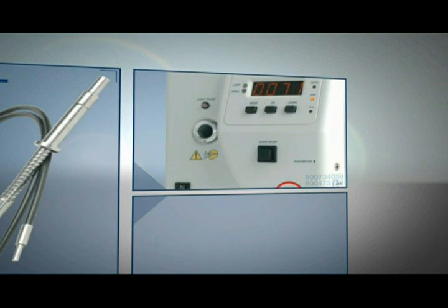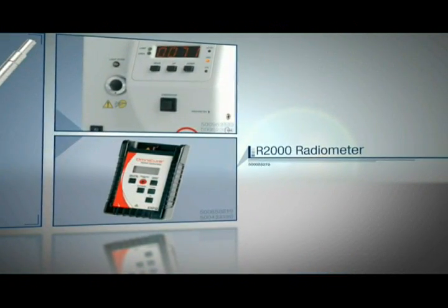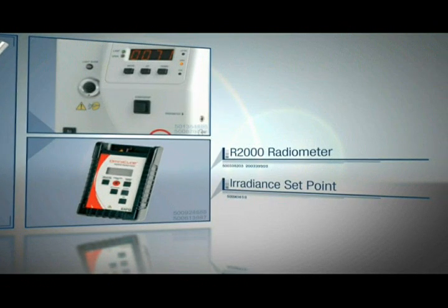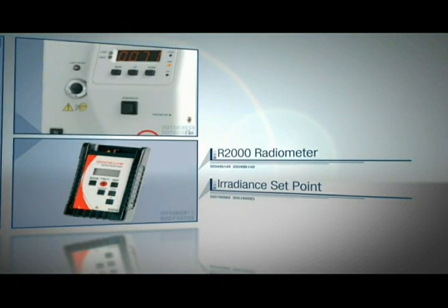The light output from the high power fiber light guide is measured with an R2000 radiometer. For this example, the Omnicure S2000 is calibrated to an irradiance set point of 2.5 watts per square centimeter, and the timer is set for 10 seconds.